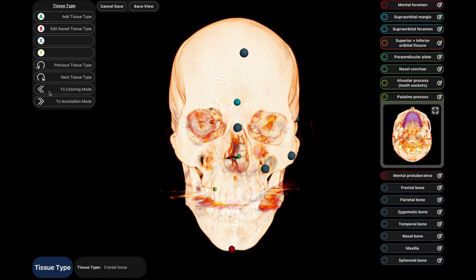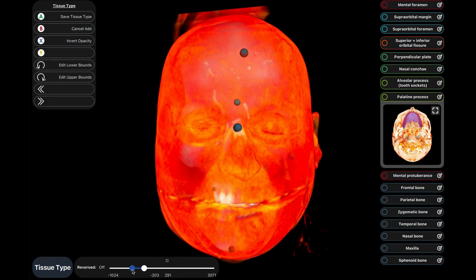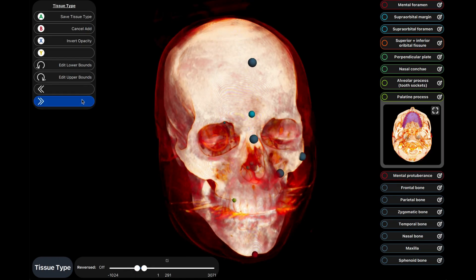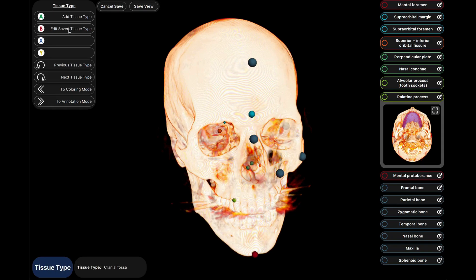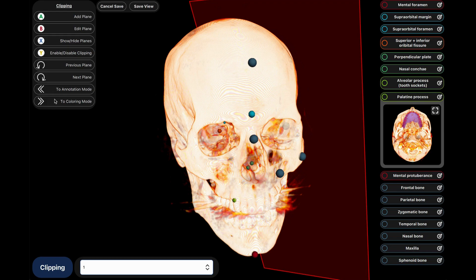Within the various modes, there will also be two sub modes: one to add a feature and one to edit an existing feature. When you enter into a sub mode to complete an action, this blue menu will turn grey. Within a sub mode, you will not be able to change modes. This is to prevent accidental navigation while performing actions. By exiting out of the sub mode menu, the grey will turn back to blue, signaling you are back in the original mode menu, and you can once again cycle between modes.